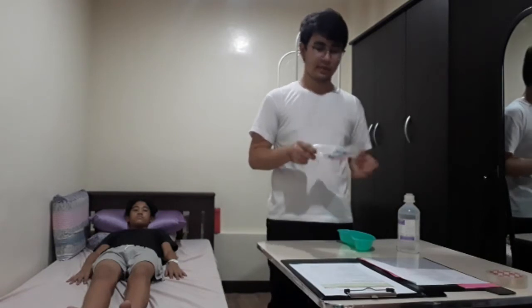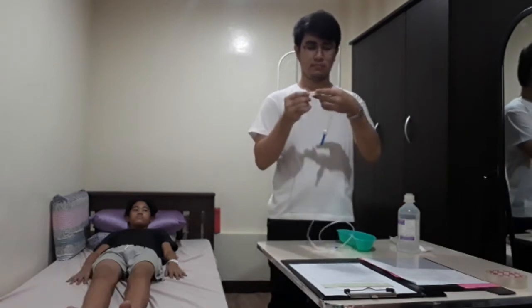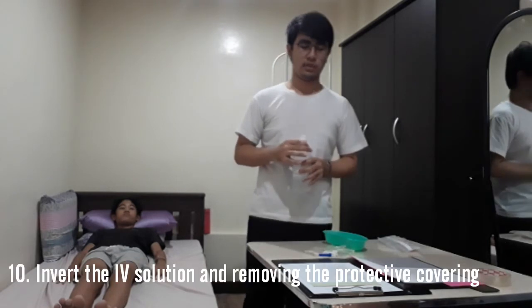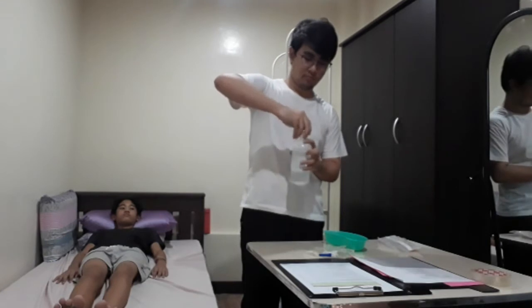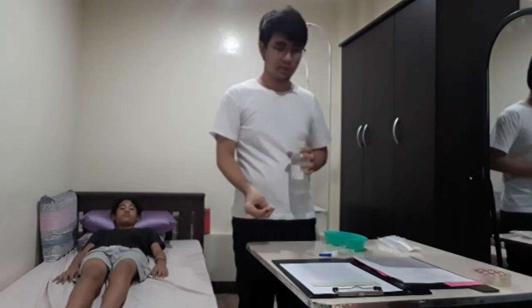Then after removing the packaging, we will now close the roller clamp or side clamp on the administration set. So we'll close it. Okay, so it's closed. So after closing the roller clamp, we will now invert the IV solution container and remove the protective covering on the entry port. Okay, so we're done removing it.